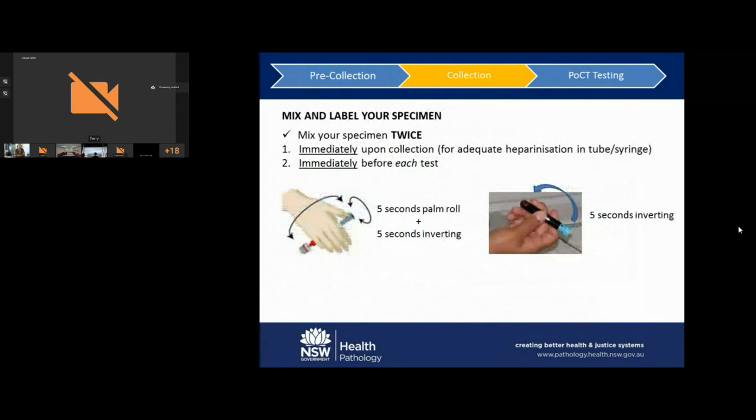It is best practice to always mix your specimens twice. The first time is immediately after collecting to ensure the blood mixes well with the syringe or tubed heparin to prevent clotting. The second time is just before you apply the sample to the point of care device. This ensures the sample is fully homogeneous when tested. For syringes, we recommend 5 seconds palm rolling and then 5 seconds inverting. So that's a full 10 seconds.